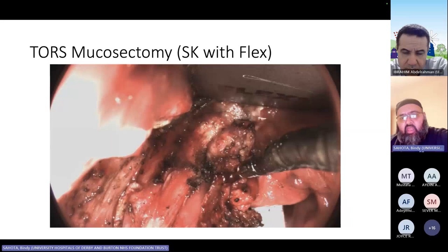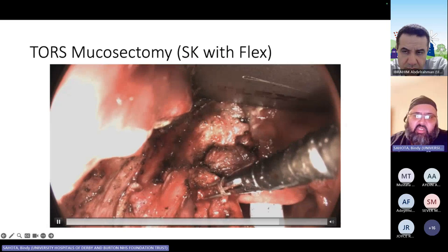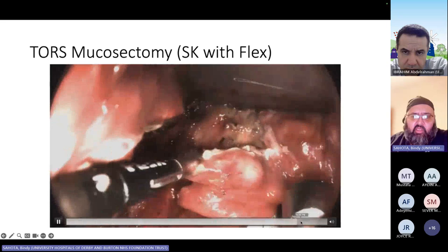And then take out your specimen, reorientate it, and relabel it up as you would do anyway. So we tend to use what are called clinic trays and pin those out on them. And then you'd repeat this on the other side, take out this tongue base on this side. I'm going to just skip a little bit of the video so you know.